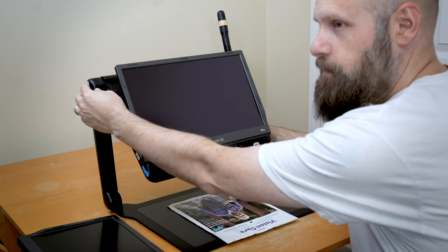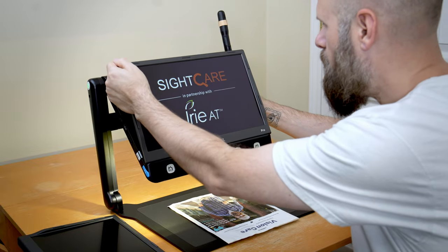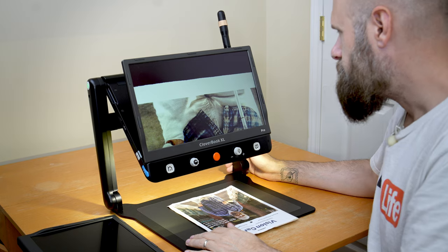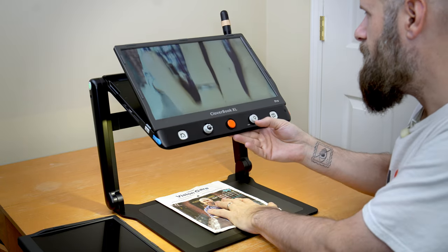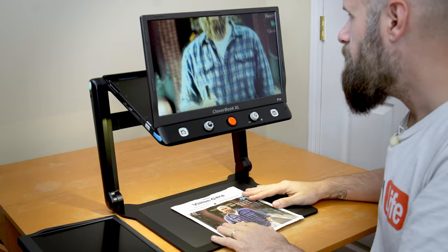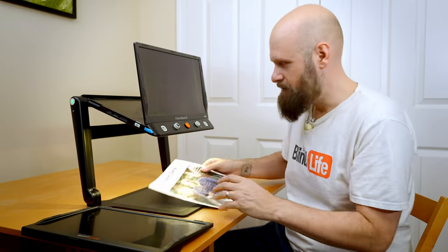Now let's check out some of the features of the XL. We long press the power button on the left side to turn it on. The light comes on, we get our splash screen, and here is our image. We can angle the device up and tilt the screen forward to get a good look. Today we're looking at an article about myself that was featured in USA Today.